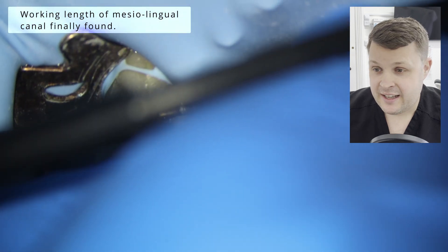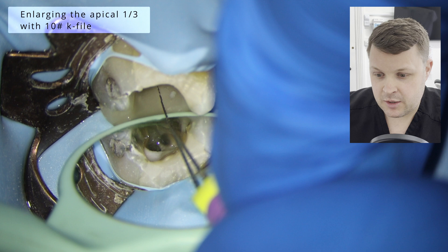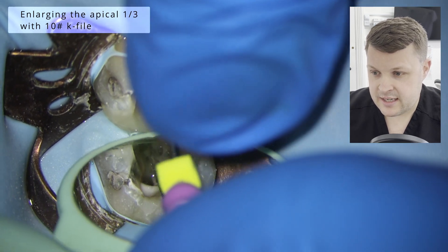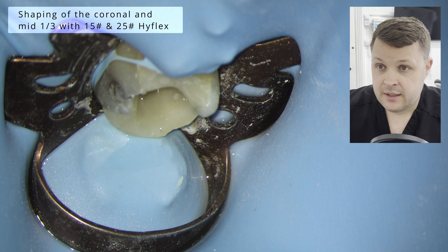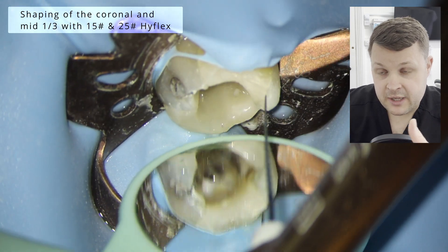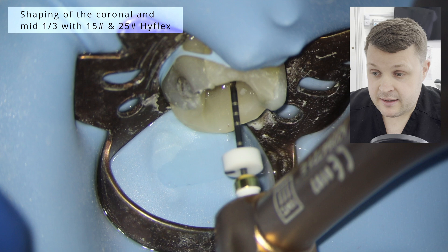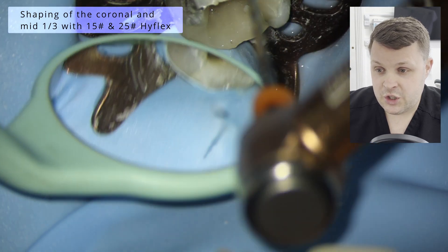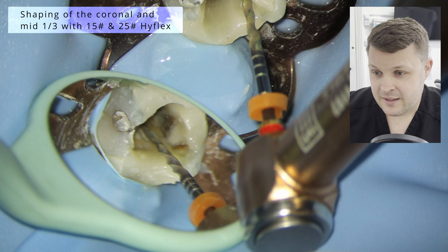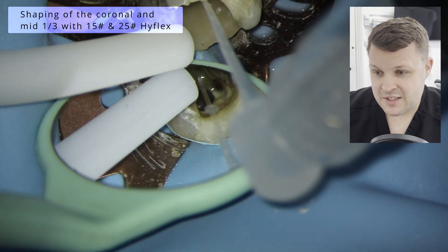I'm actually using a size eight D-finder here with a little bend at the end — and I've got a nice zero reading. So obviously if we've used an eight, we just need to open up the canal space with a 10. And then once we've got a 10 at the zero reading, we're going to use this glide path file and then finish it up with a size 25.